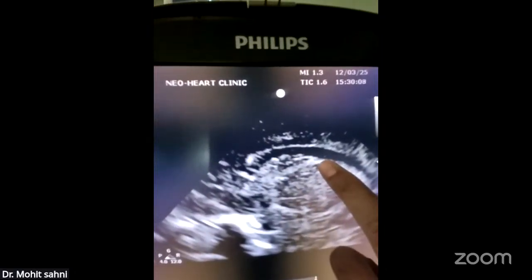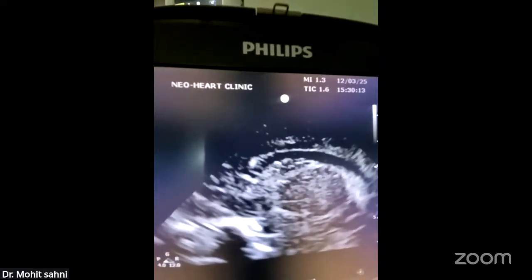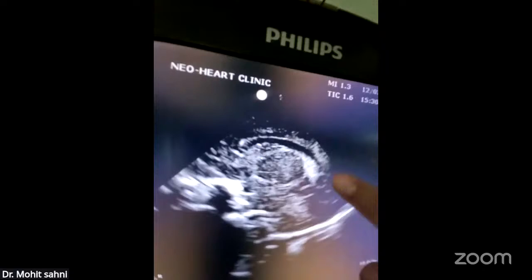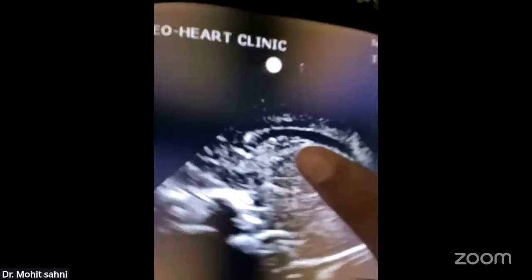This is the caudothalamic groove. The caudothalamic groove is the place where you first look for a germinal matrix bleed, or what we call a grade 1 bleed. So this is your caudothalamic groove. This is the choroid plexus. Anterior horn, occipital horn, inferior horn of the lateral ventricle, that is periventricular.